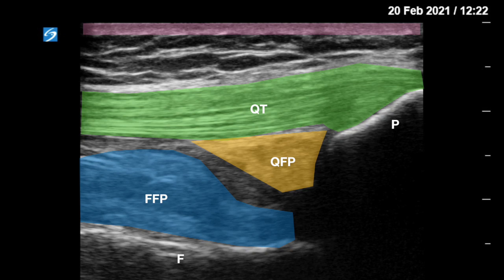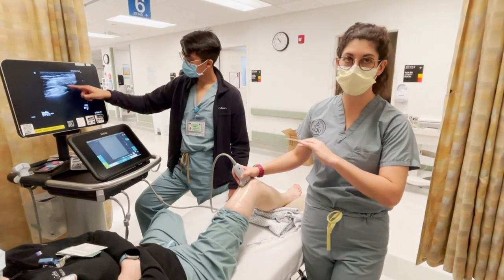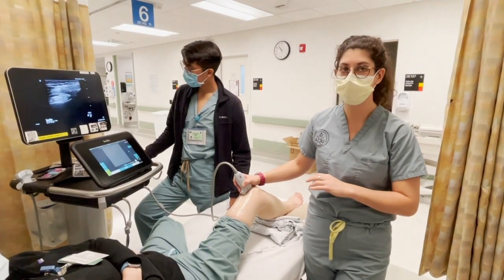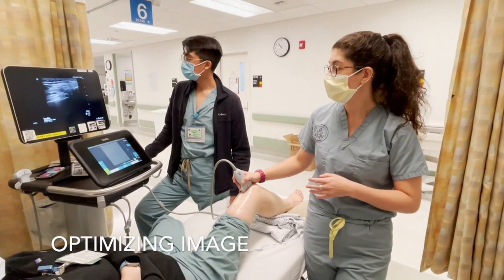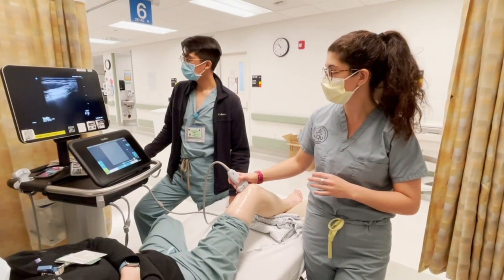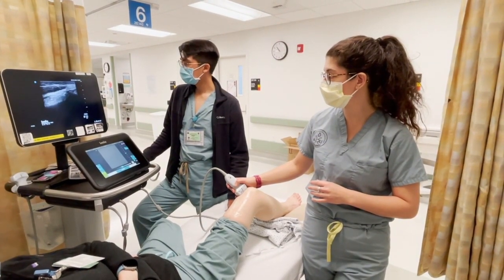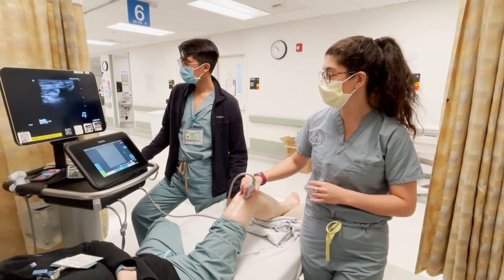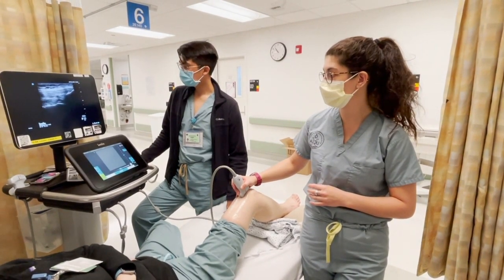You have the quadriceps fat pad just underneath the tendon itself and the femoral fat pad above the femur. In this patient we can see a small amount of black fluid between the two fat pads — that small amount of fluid is normal. In somebody with an effusion we would see a lot more fluid in this area. If you're having trouble getting a good view, ensure you are in the midline directly above the kneecap.